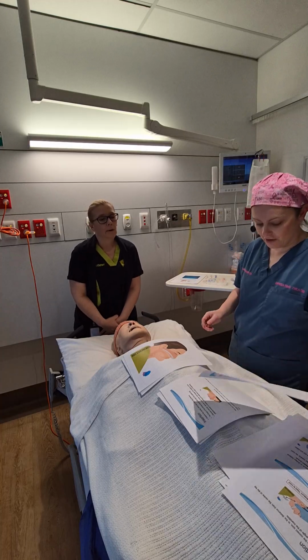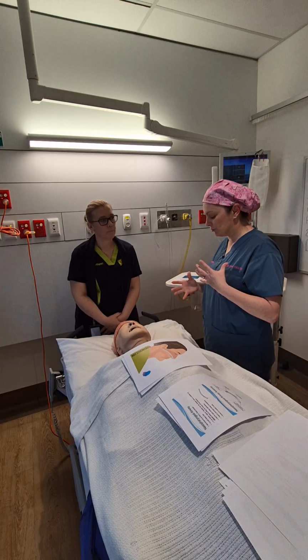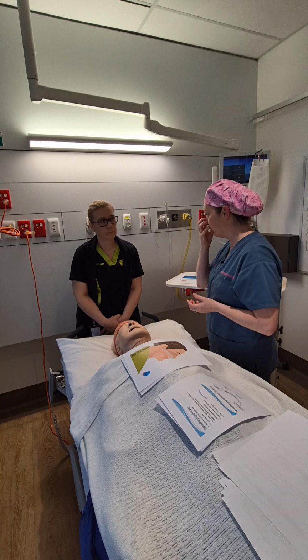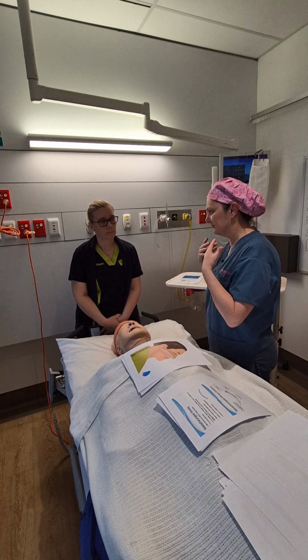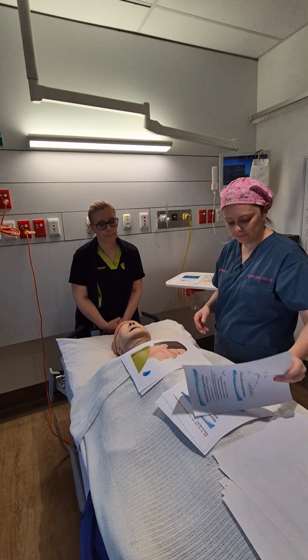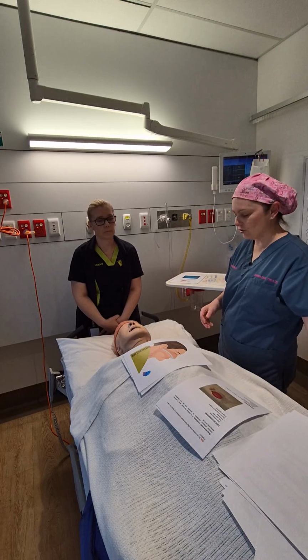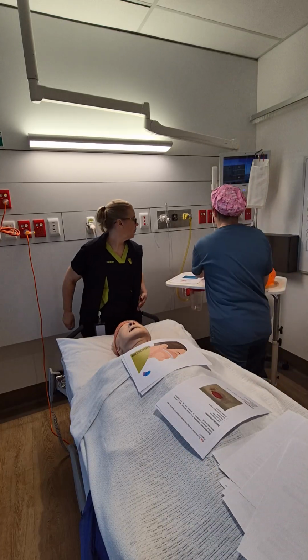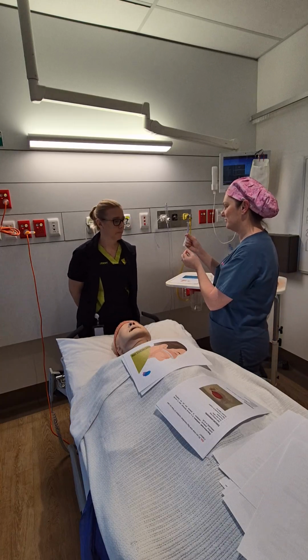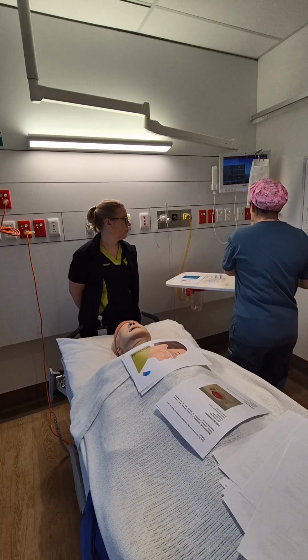Wonderful. So the only thing to be mindful of with nasopharyngeals is that you shouldn't put one in anybody that's got a base of skull fracture. Anyone that's got a nose fracture already has blood and stuff in their nose airway, and we don't want to cause more trauma and more damage. Alrighties. You can also see that they come from very, very big to very, very tiny. So that's for a neonate and that's for a large adult. And then we'll move on to bag mask ventilation.